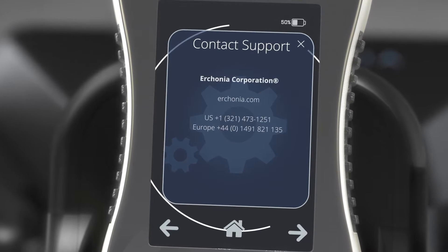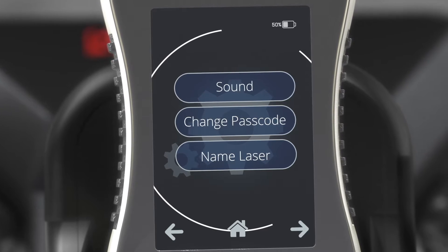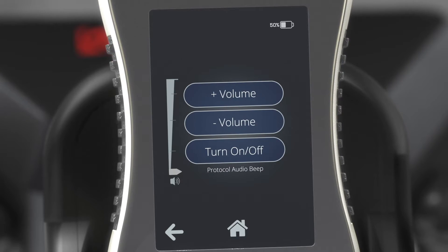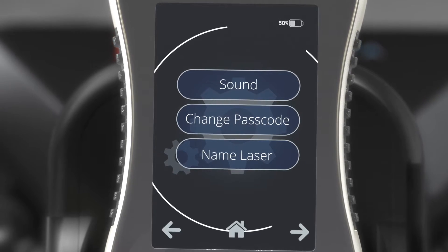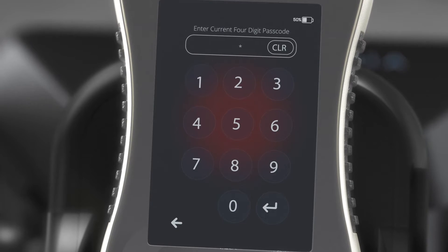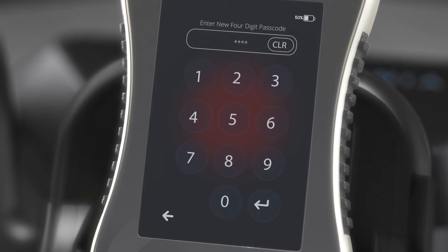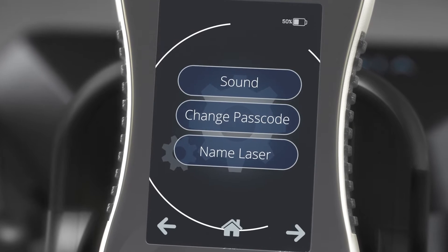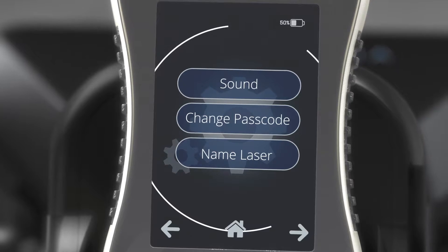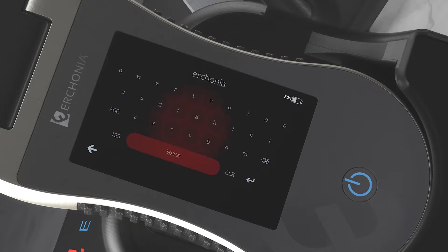Contact Support will show Urconia contact information. Let's take a look at personalization mode. Sound will allow you to adjust the volume up, down, or toggle it on and off. To change the passcode, first enter the current passcode and press Enter, then input the new passcode and press Enter. Re-input the new passcode again and press Enter — the device passcode is now changed. You can also personalize your laser by naming it; input the desired name and the home screen will display the new name.